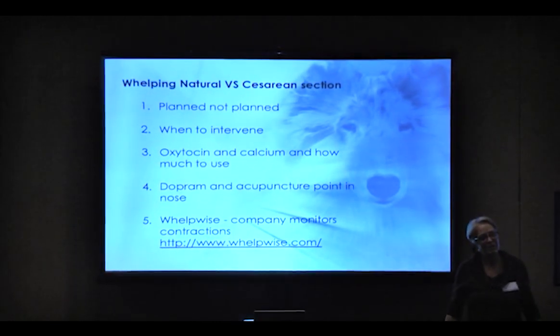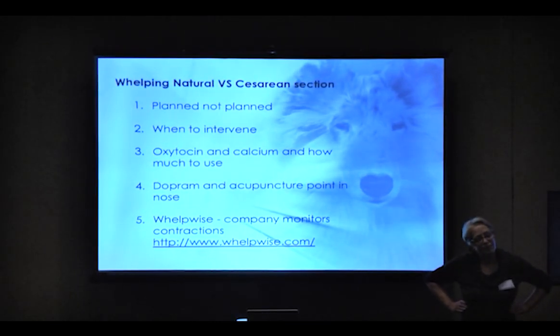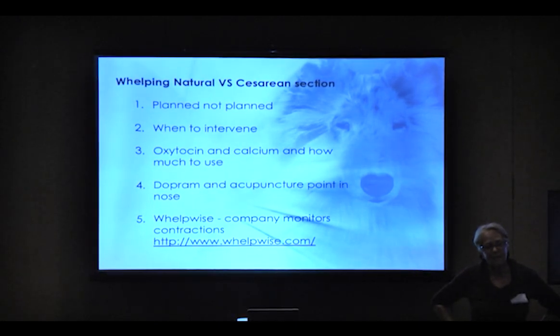Yes? Is there a way to monitor the contractions at home ourselves? Unless you get a Doppler, not really. You really have to have a Doppler. It's easy to get a Doppler. You can order them online in some places. But then you've got to be trained. Yeah, you can get one. What I would do is go through it once with WhelpWise, and then you just do it on your own. So you can do it like that.